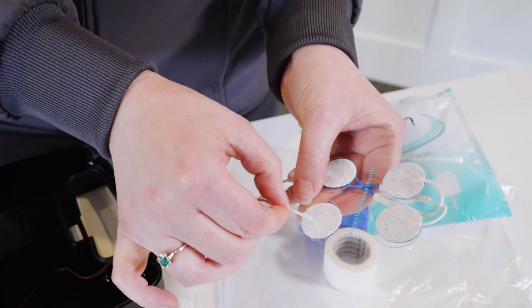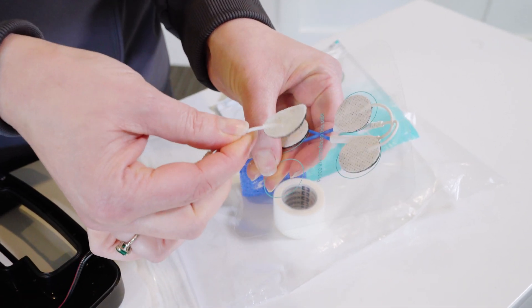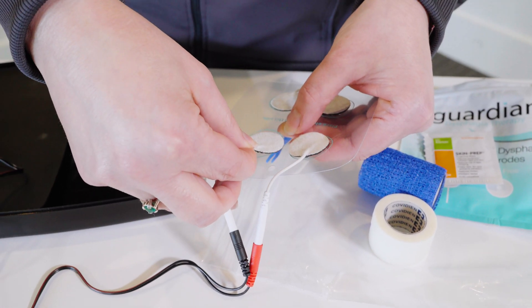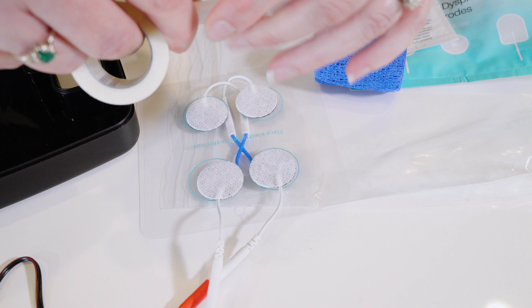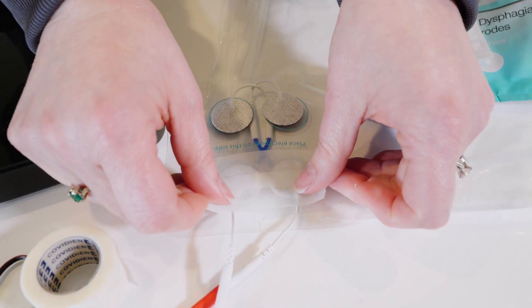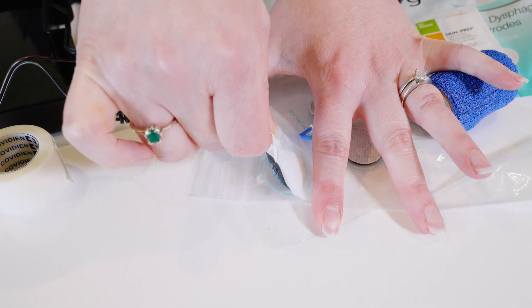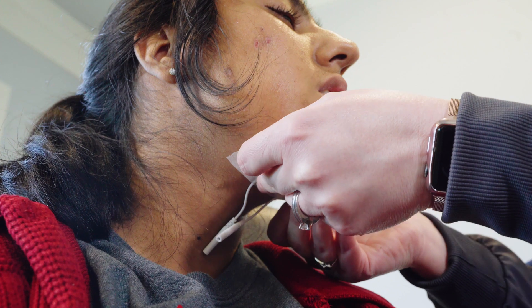The lead wires can be placed just by peeling them from the plastic. You're going to want to hold on to this just like a lollipop, and that firm wire is going to stay intact while you place it on the patient. Depending on where you're placing those electrodes, you might also find it helpful to use the paper tape that's included. You can space your electrodes on the plastic based on the patient you're working with — they may be closer or farther apart — and just use a couple of pieces of tape. This keeps those electrodes spaced for you and makes it a little bit easier to hold on to them as you place them. When you remove them, you can hold on to the tape and the lead wires and pull them off all as one piece.